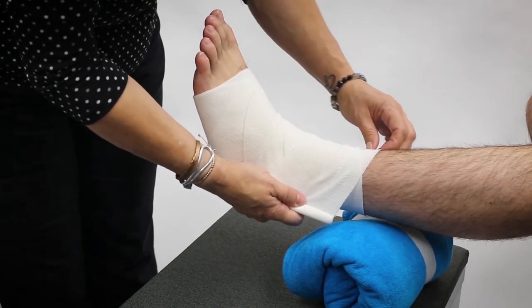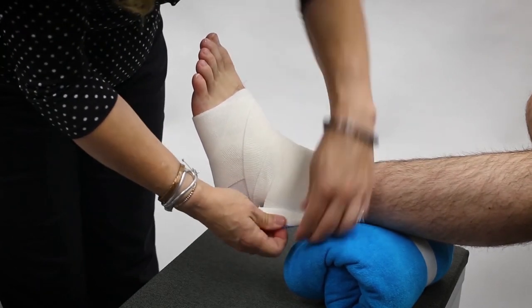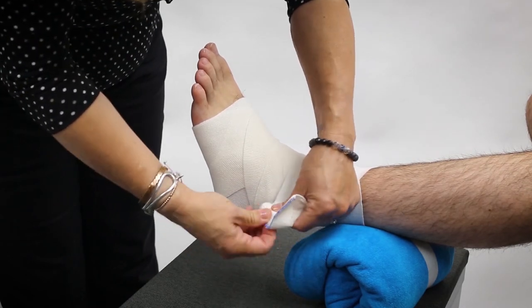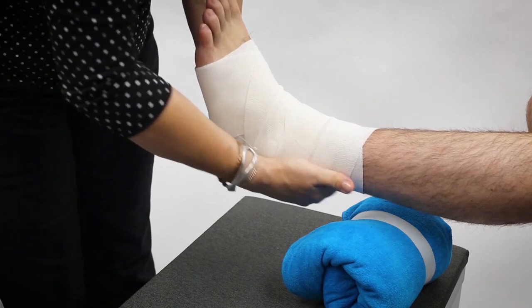We're going to make sure that we're going a little bit above the ankle. With this wrap it is a little bit easier because it does have the hook-and-eye or velcro closure, which allows us just to pull it over.